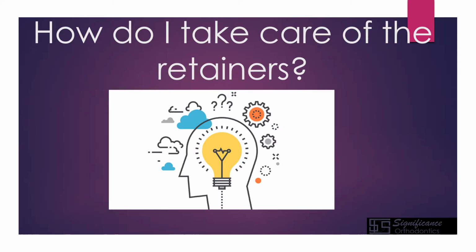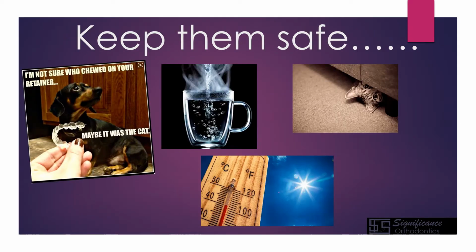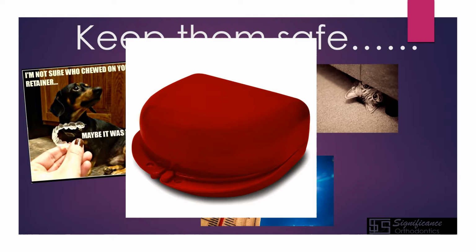Now, how do you take care of the retainers? Let's go over that. So you want to keep them safe. So keep in mind, dogs will chew them. Cats will hide them. And if you live in Las Vegas, as probably most of us do, it gets hot here. So please do not leave them in your car. We also get questions, well, how can I sterilize my retainers? Please don't put them in hot water. They're plastic and they will melt and distort. Now, remember that case I gave you?